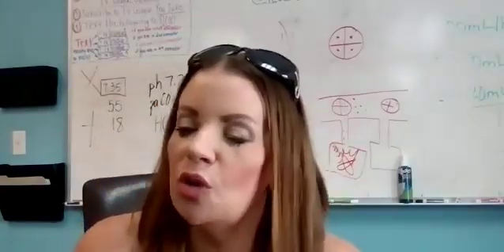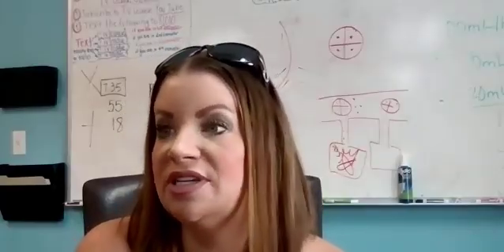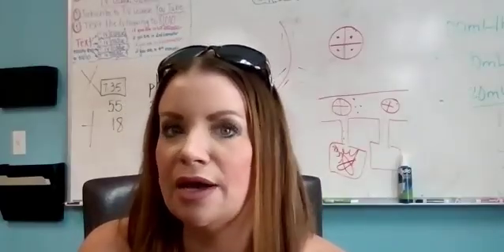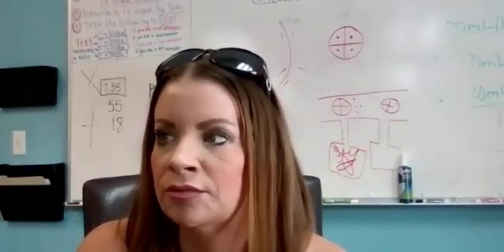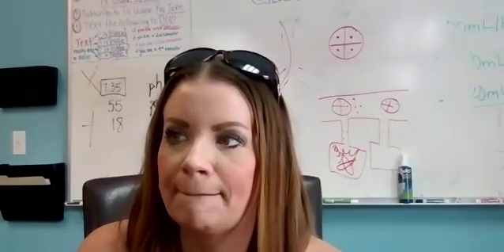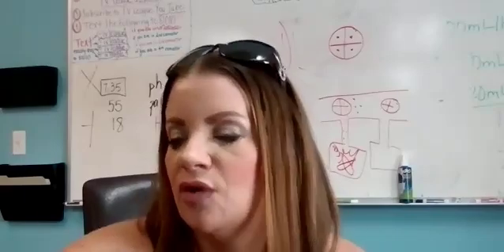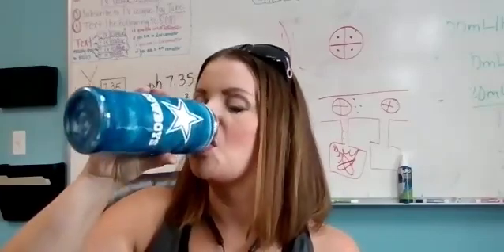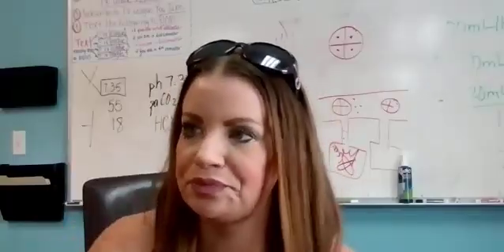So we usually use CPAP for OSA, which you already told me, and we'll use it for CHF. Why would we do that? In CHF, you have a lot of fluid retention. But why would I need to open my alveoli? Because there's pressure on you.